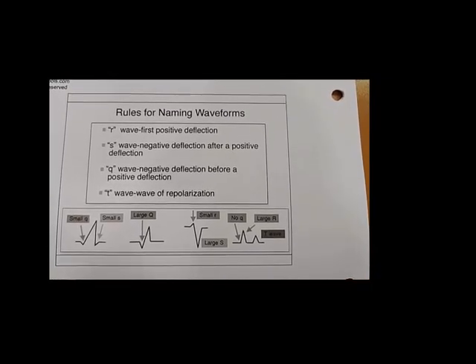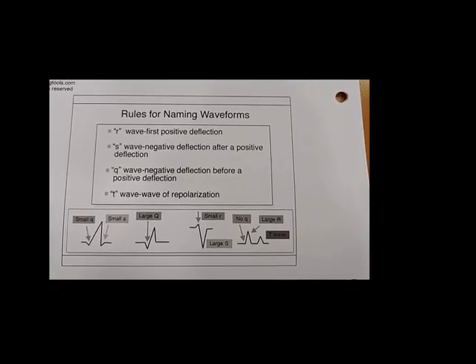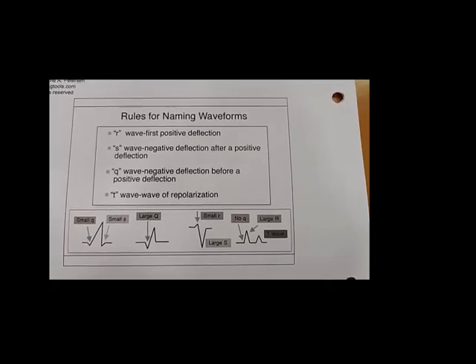One of the questions that has come up with the EKG refresher and just in general is about Q waves. So I'm just going to talk for a minute about Q waves.